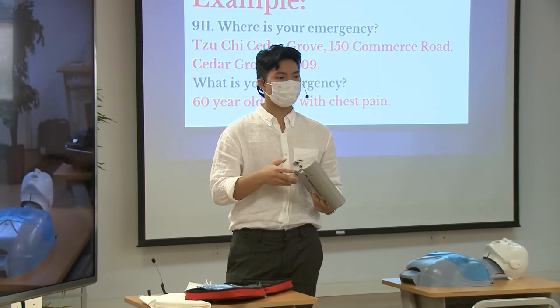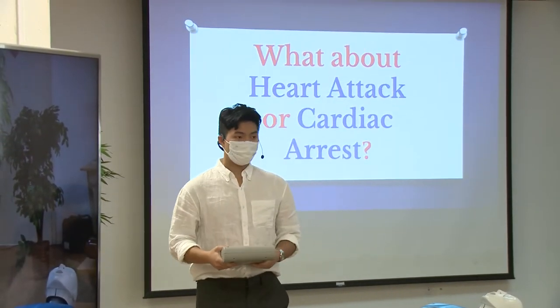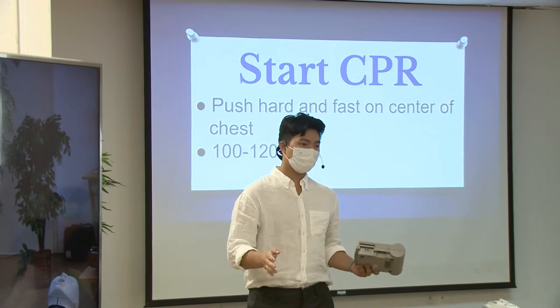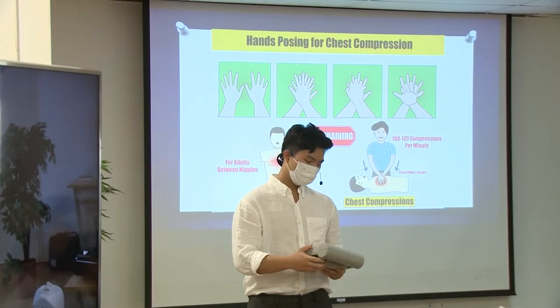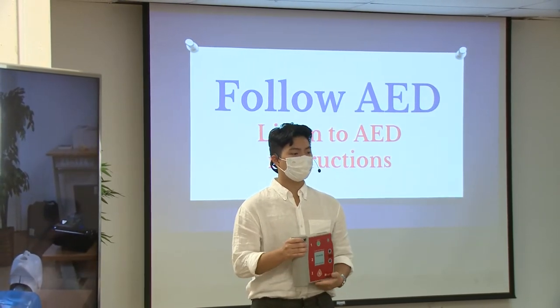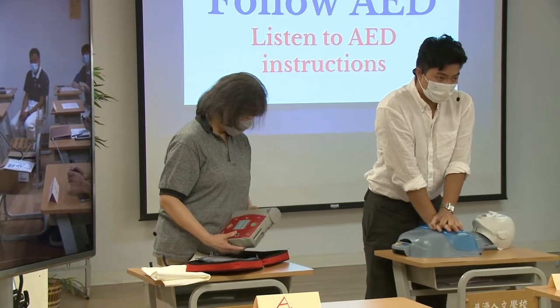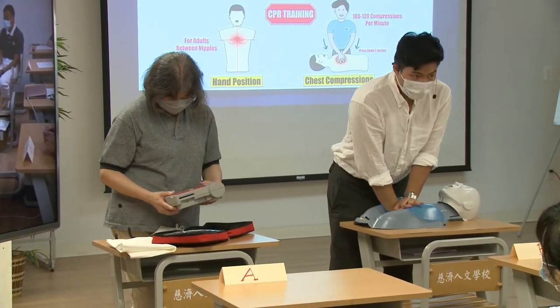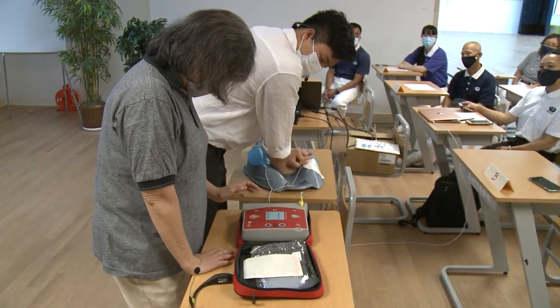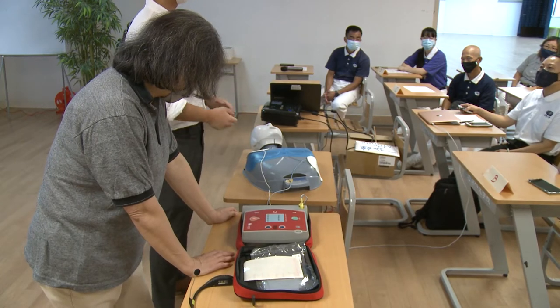To analyze rhythm, no one can touch the patient, so you just make sure everyone is off of the patient. If it says shock advised, this orange button will start glowing. You make sure everyone is not touching the patient before you press this orange button. What it does is it sends electricity through the patient. If you're touching them, you may be affected. You might impact how the patient gets. There's two options. If you're getting tired and the other person knows how to do CPR, then they can switch out with you. So when you hear that, analyzing heart rhythm, do not touch the patient.